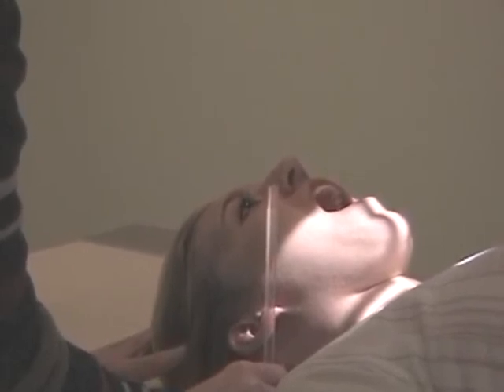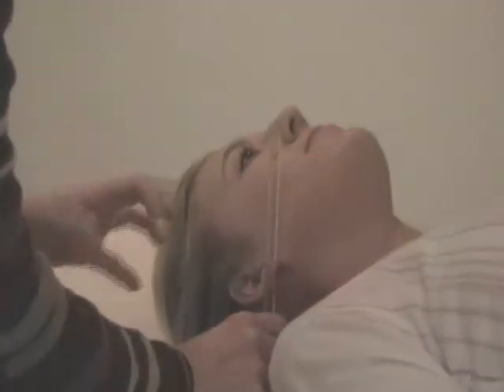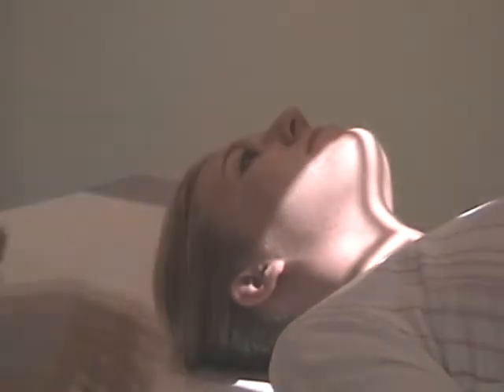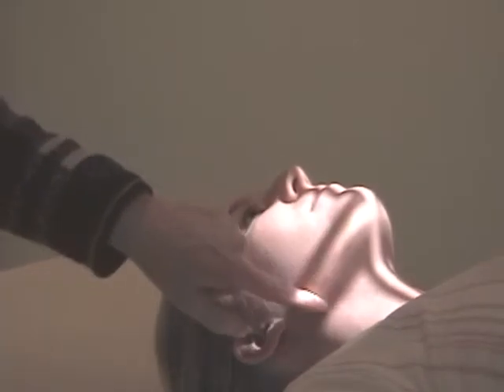So I'm happy with that position. I ask the patient to close her mouth, but do not move her head. Make sure you pay attention to the head, because as somebody opens and closes their mouth, they might tip their head forward or back. Now what I'm going to do is, remember I told you I had a 15 to 20 degree cephalic tube angle. I've put the crosshairs of the tube over her mandible so you can see here.